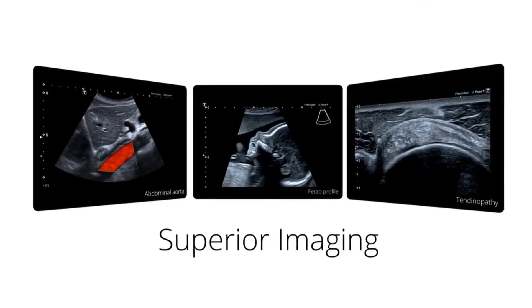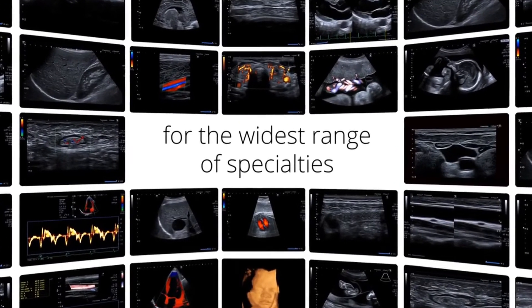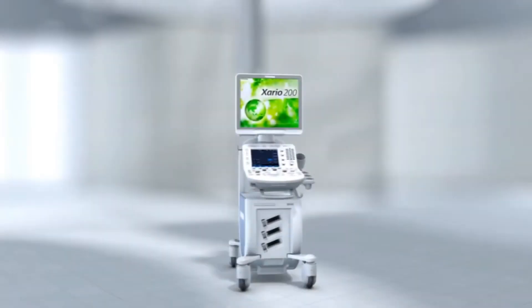The system features key imaging technologies migrated from our flagship Aplio series. It also delivers outstanding clinical performance for routine and advanced studies in the widest range of clinical settings.